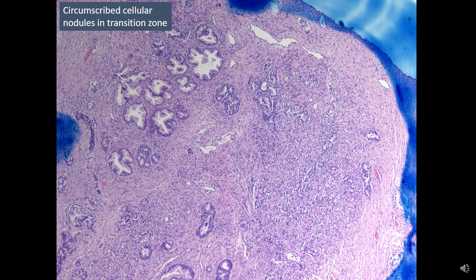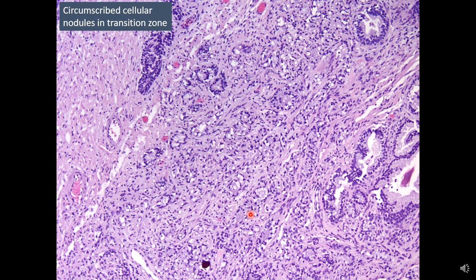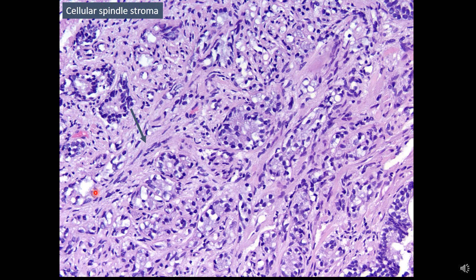Getting back to our case, you have multiple cellular spindly nodules at low power magnification. A very important feature to appreciate here is this very sharply circumscribed cellular nodules. At higher magnification, notice this very cellular spindly stroma — like BPH type of stroma — and when you see this type of stroma you always think about proliferative benign conditions.